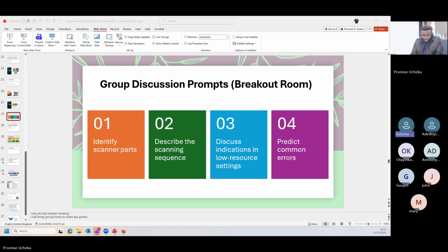When you have a distortion with the bite, there are people who find it difficult, maybe as a result of the alignment of their teeth. As you're taking the bite registration, it tells you that the bite registration is not good.